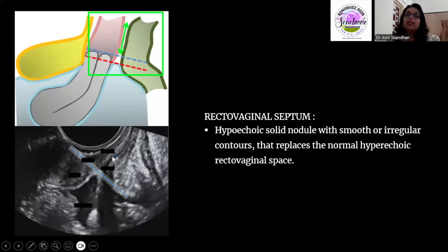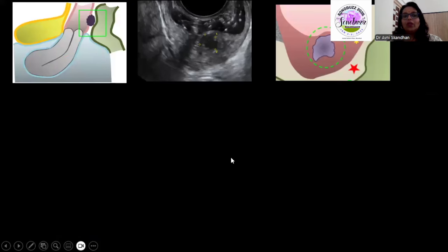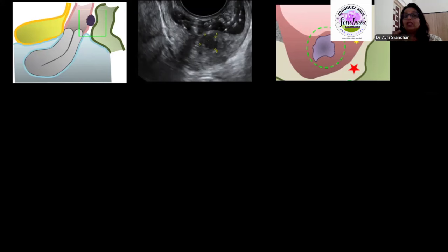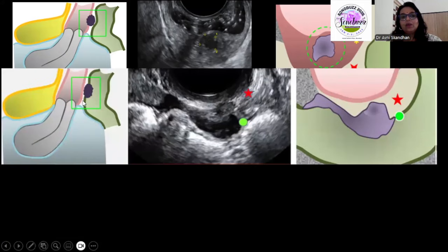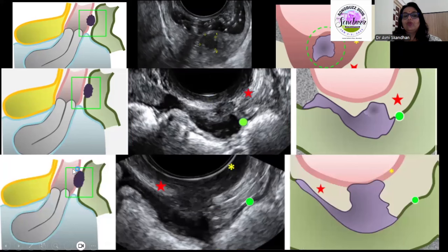The rectovaginal septum is something that can be easily missed, which is why our role is important in identifying deposits in this region. A deposit can arise from the posterior vaginal wall infiltrating into the rectovaginal septum. To better appreciate the vaginal wall, we can instill jelly or saline into the vaginal cavity to distend it. Alternatively, a deposit in the rectum can protrude into the rectovaginal septum, or you can see a through-and-through deposit from vaginal wall to rectum involving the rectovaginal septum.